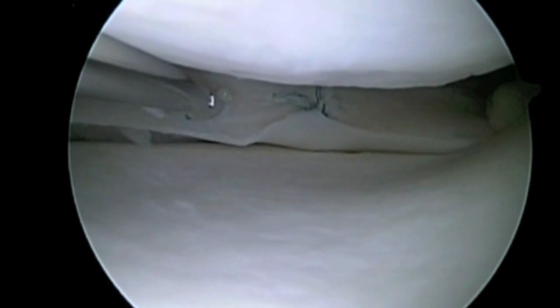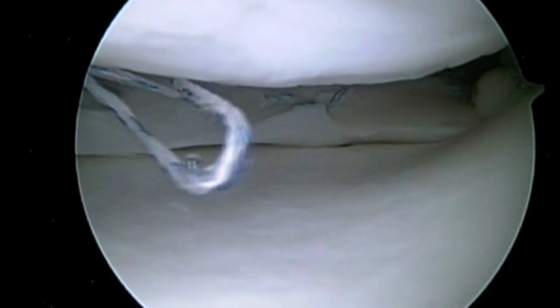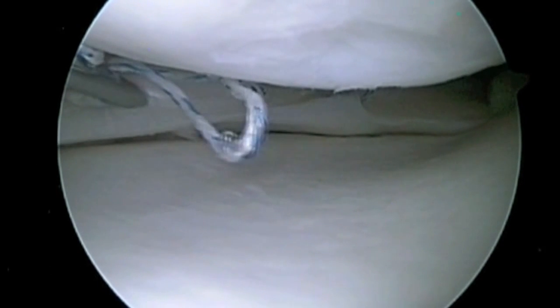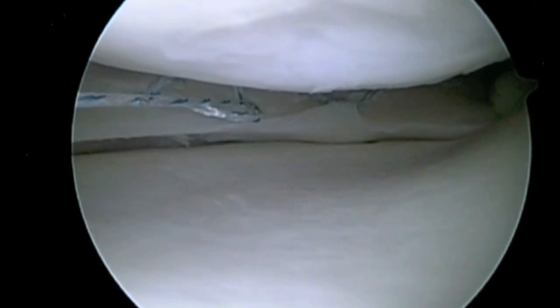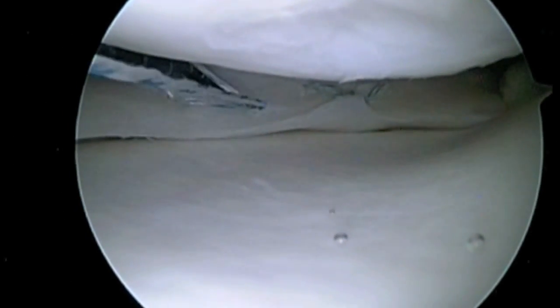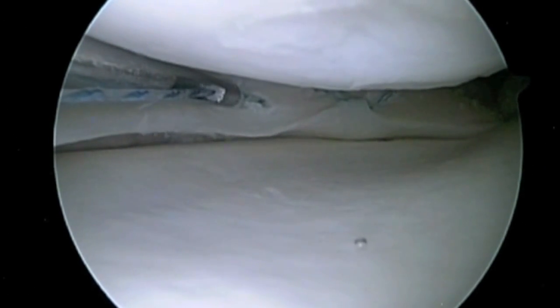A second meniscal suture device is then implanted. This is placed about 4 to 5 millimeters away from the previous suture. The second limb of the suture is then passed. The repair is tidied so there is equal tension on the loops as the sliding knot is pulled down. This compresses the edges of the tear very close together.